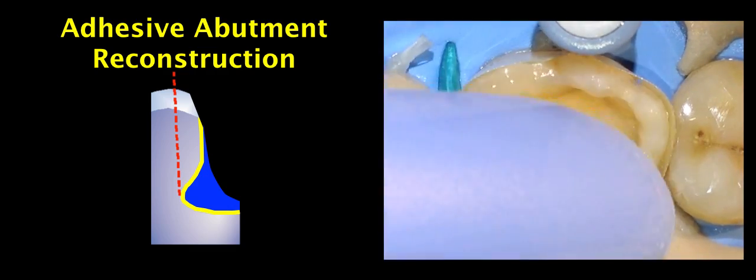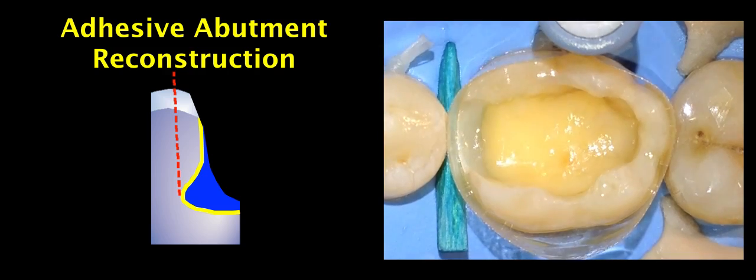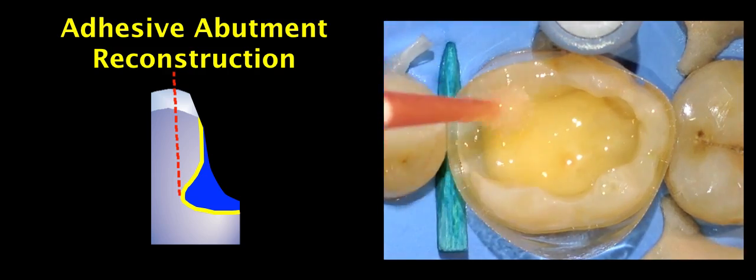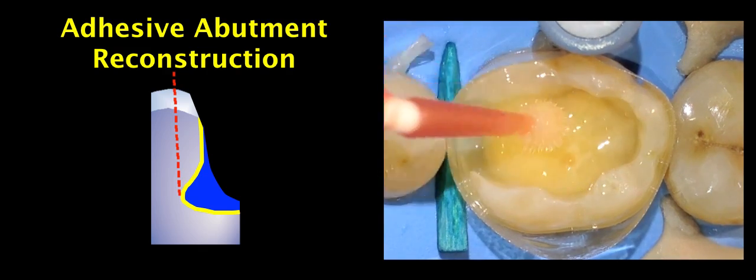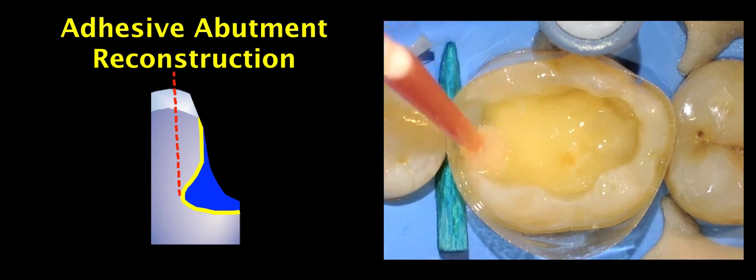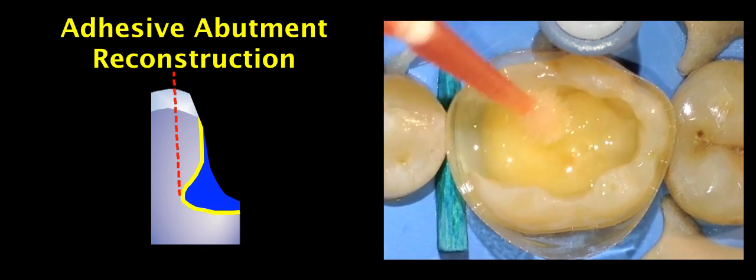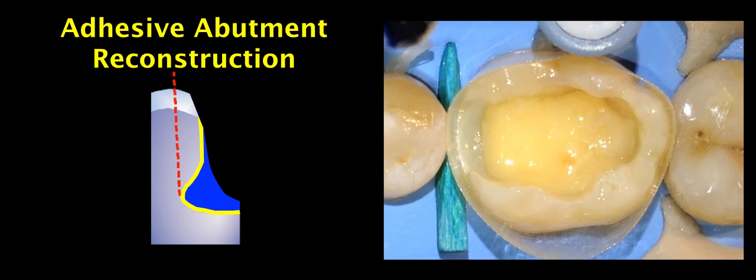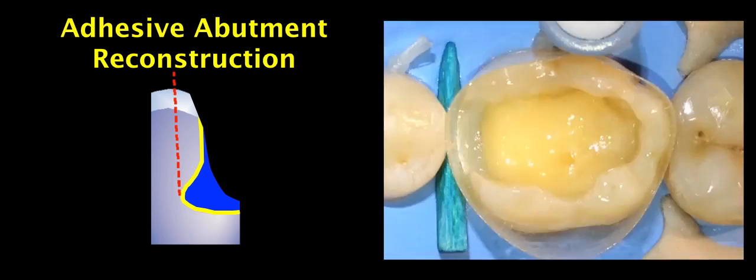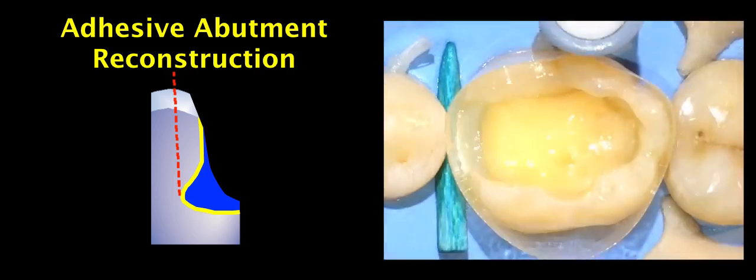Then the excess is removed with a vacuum and you can use thin air. Then the adhesive resin is placed also with a microbrush and is scrubbed on the dentin because this has also shown to produce better results. We leave another 30 seconds for the adhesive to give it the ability to penetrate well in the conditioned dentin. We constantly rub the adhesive and then we remove the excess with the help of a vacuum. We can use a thin air stream to make sure that we have thin layer everywhere and then it's cured for 30 seconds.